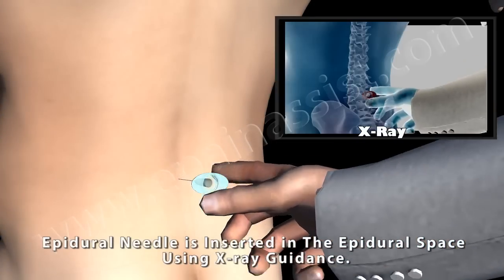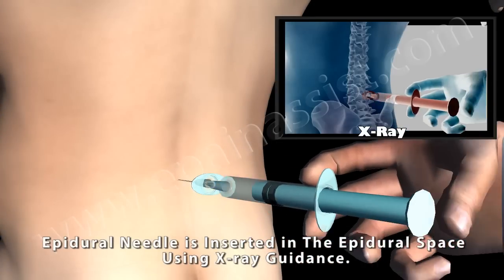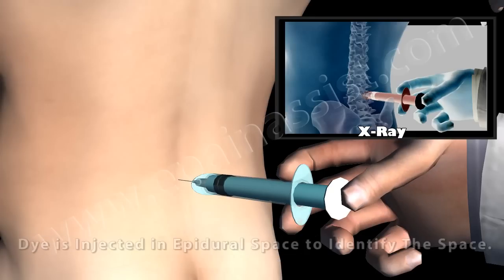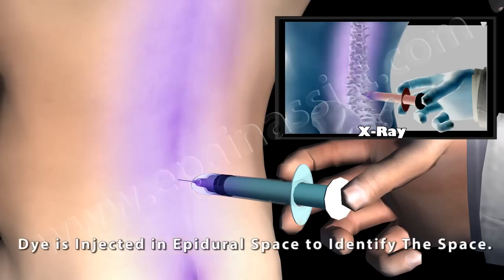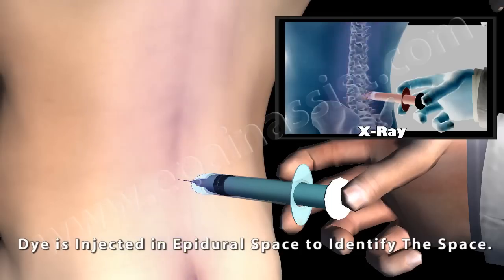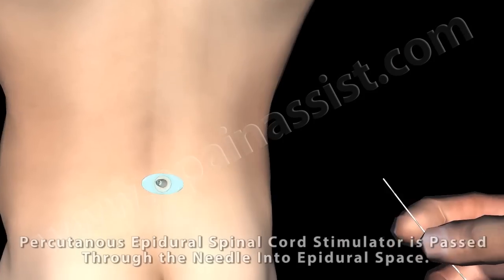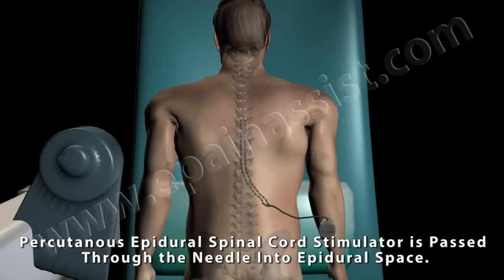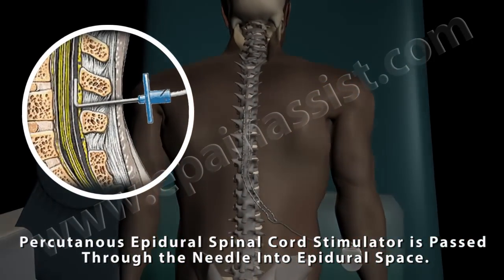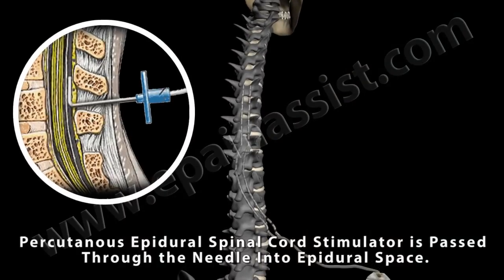The epidural needle is inserted into the epidural space using X-ray guidance. Dye is injected into the epidural space to identify the space. A percutaneous epidural spinal cord stimulator is then passed through the needle into the epidural space.